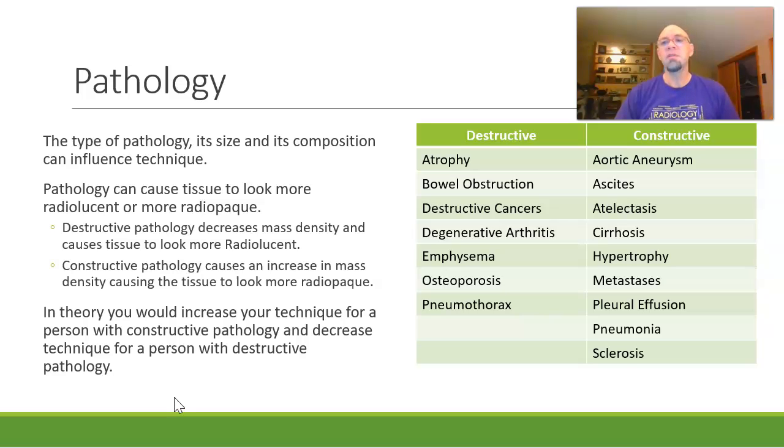Again, you want to remember that whenever you have a pathology associated with fluid or liquid or anything like that, it's going to be constructive. It's adding that in the way. If you have something that's associated with air, or lack of air, then you're looking at destructive. So I'm thinking of bowel obstruction, emphysema, pneumothorax. With constructive, with the fluid, ascites, let me see what else we got here, pleural effusion, things like that. I think we've discussed these a few times. And if you have any questions about any of them, please let me know.